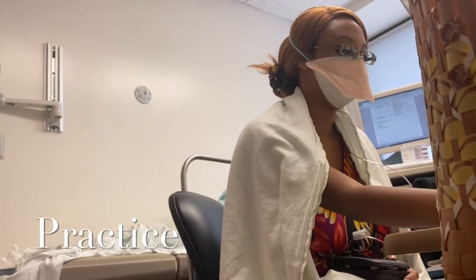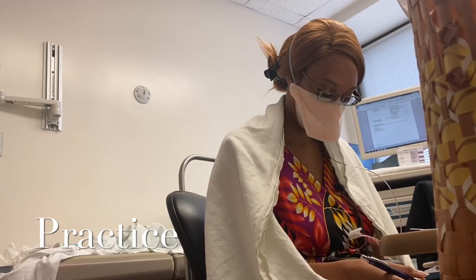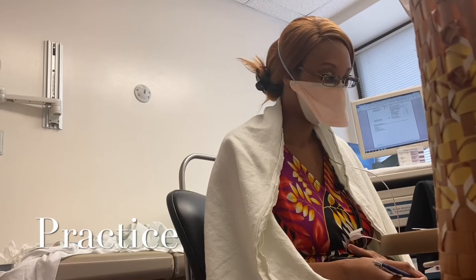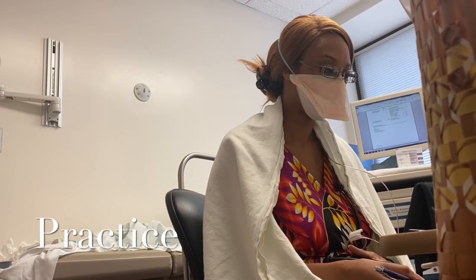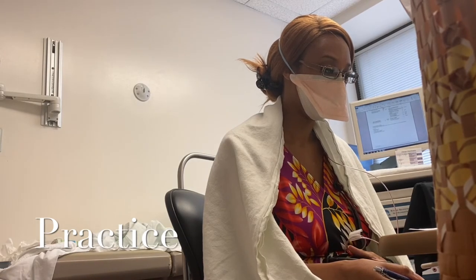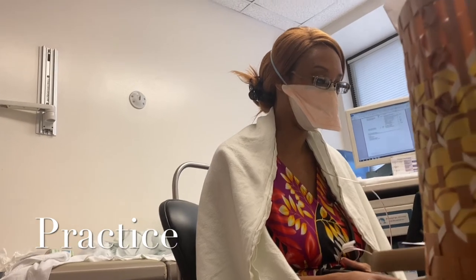The symptoms that you have checked are chest pain and regurgitation. And the company made 3 green buttons for symptoms. The first green button is number one for heartburn, number two, chest pain, number three, regurgitation. So you don't have the heartburn one. So these are the ones you may possibly push. And I usually say if you get about 5 or 10 a day in of that one symptom, that's enough for that one. You don't have to keep doing it each and every time, okay?